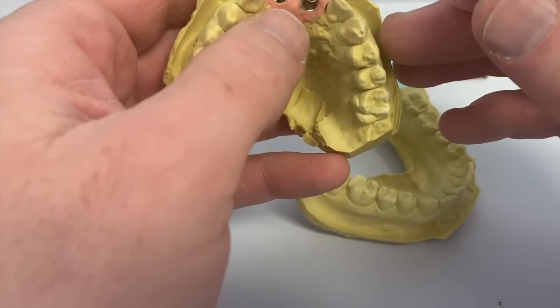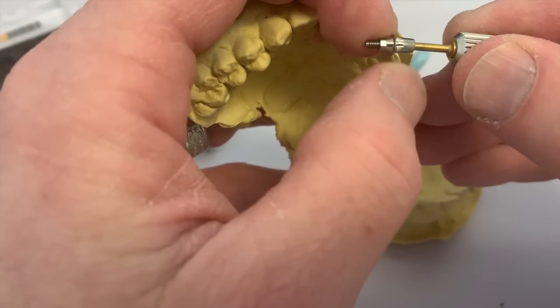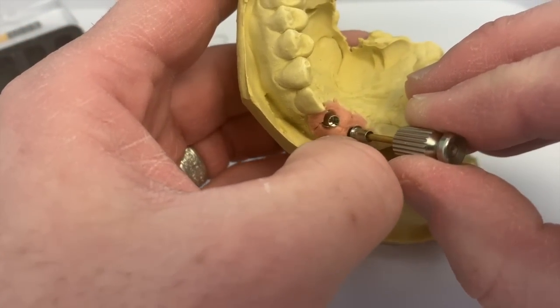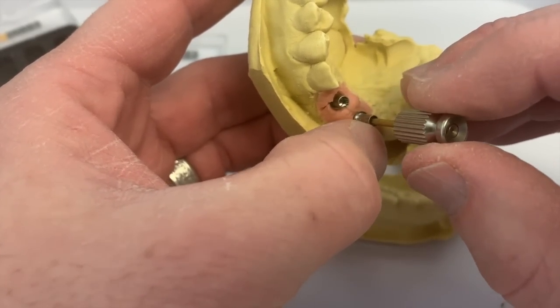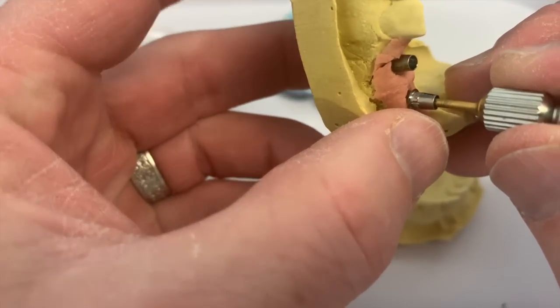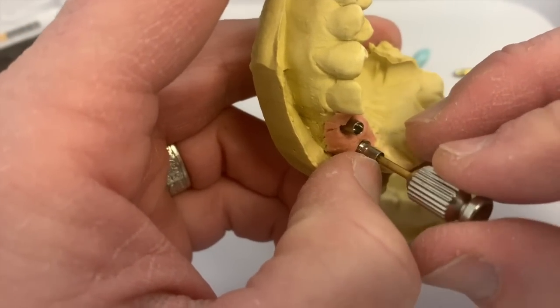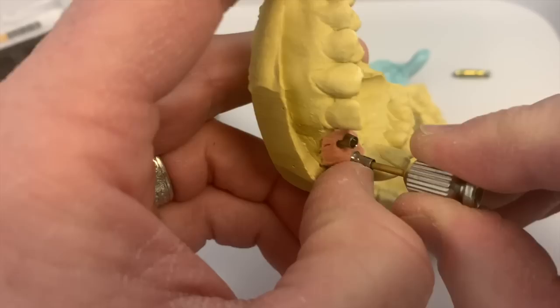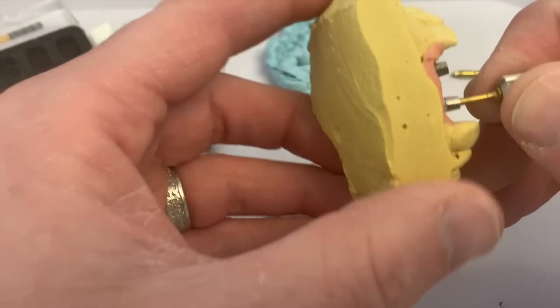Now with this one, I'm going to intentionally place, this is tooth number 8 now, I'm going to place the notch and the groove to the mesial. And the rationale behind that is I want that sprue to be positioned, once we're done designing, to the lingual, where the highest, tallest height of that custom abutment that I'm going to make will be. Let's see if I can get this to engage. There we go. Sometimes you got to work them a little bit to get the hex to slide into place.